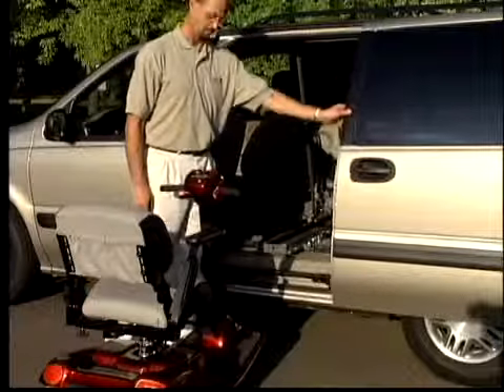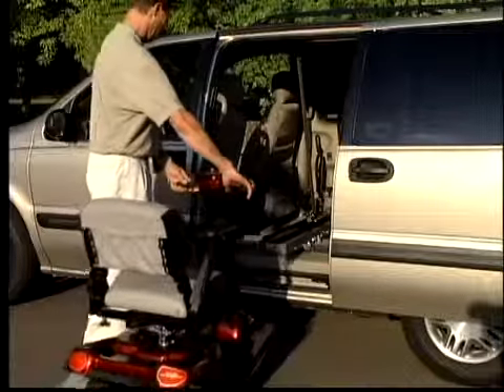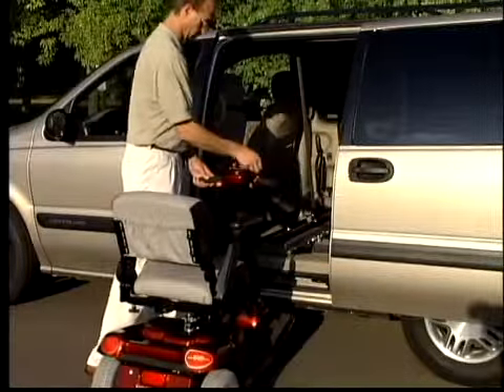In vehicles with automatic sliding doors on the driver's side, you can easily access your wheelchair or scooter from the sitting position of the driver's seat.